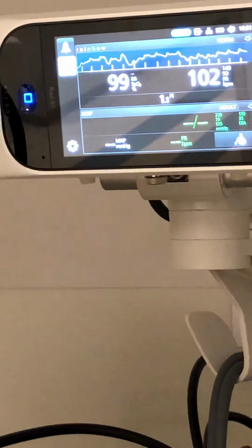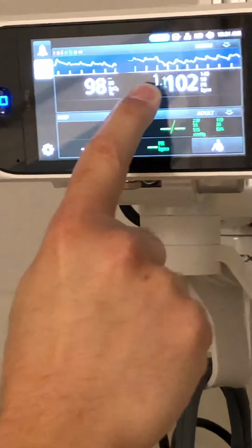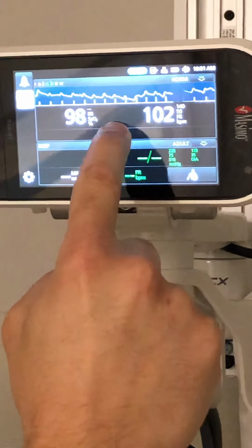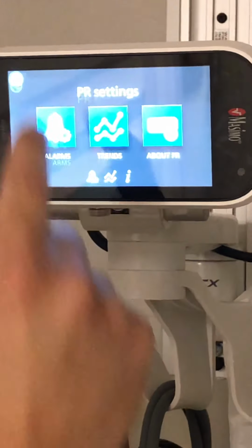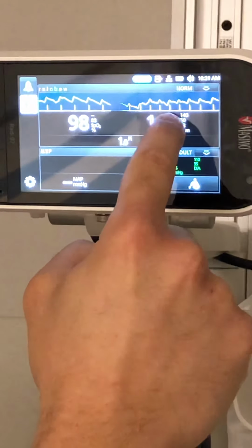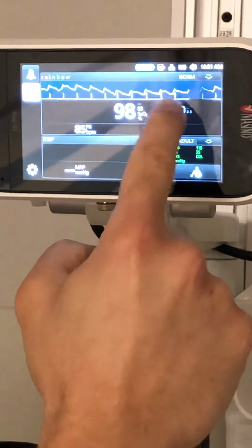And just to show you guys, this is a touchscreen monitor. You can move things around just like apps on your cell phone. So if you click and hold it, you can drag that up into the window here. If my finger works. Sorry. Drag this one down. Pull this one up.